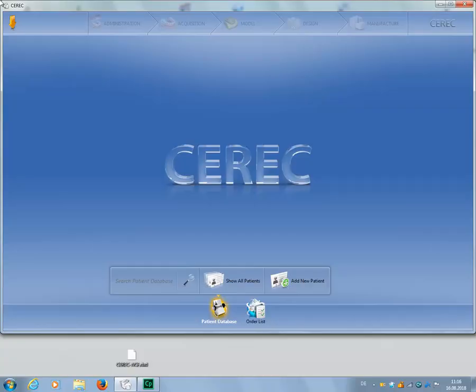After we have ordered an Atlantis core file from the Atlantis web order page and downloaded the right format for importing into the CEREC software, we then open the CEREC software. For the import, you will need a .dxd file. In our case, this has been saved to the desktop.